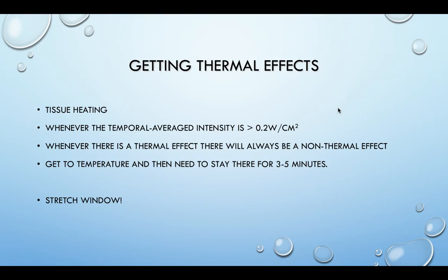With that stretch window that we've talked about too, if we're trying to get to that vigorous heating, when we're trying to actually get the collagen to relax and loosen and to decrease the viscosity, we want to manipulate that stretch window. As the temperature is up in that 3 to 4 degree increase, we want to be stretching while we're doing the ultrasound. And then we have about a 5-minute window where we can continue to gain stretching, either by what we would consider stretching, or joint mobilizations, or potentially traction.